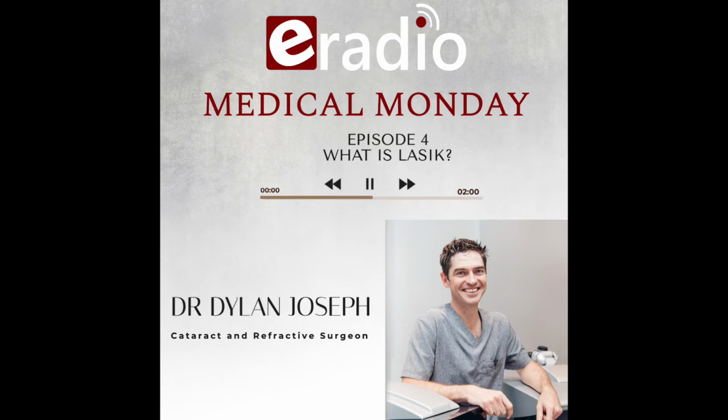Now, going back to the technology that you asked about, the lasers are the area that has changed most dramatically. I touched on it briefly a few weeks ago when we talked about the previous laser profiles. Those initial lasers could only laser in a certain diameter, so often about the size of your pupil, if not larger, and that was what resulted in those nighttime visual symptoms of possibly glare and halo and starburst, etc. They did what's called a broad beam laser pattern.